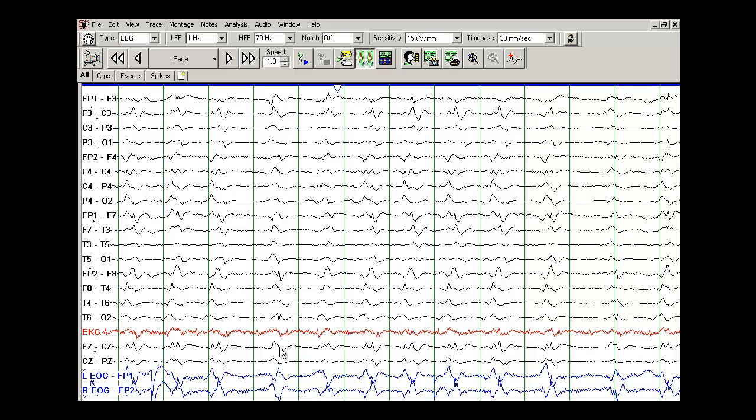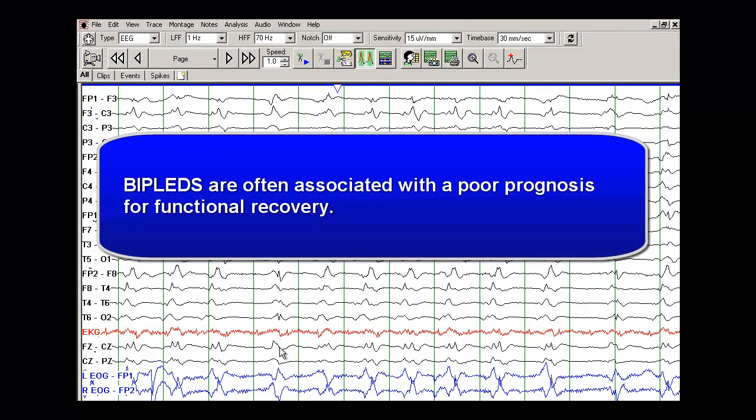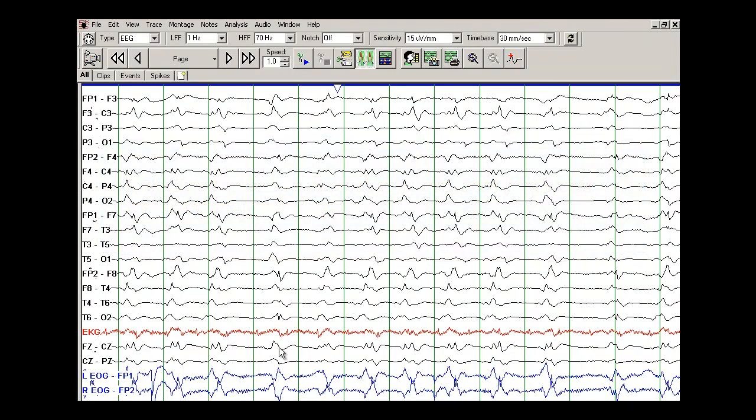if you find a patient with BIPLEDs, it typically suggests a poor prognosis for functional recovery. A lot of these patients will also demonstrate abnormal cortical signal bilaterally.